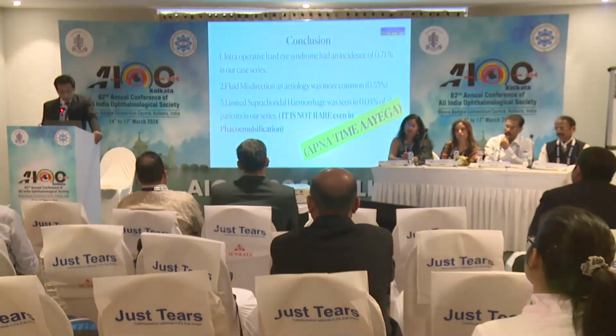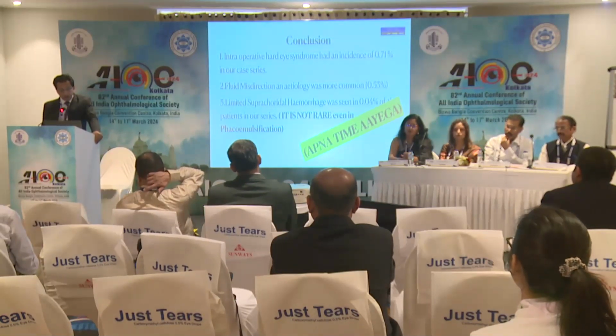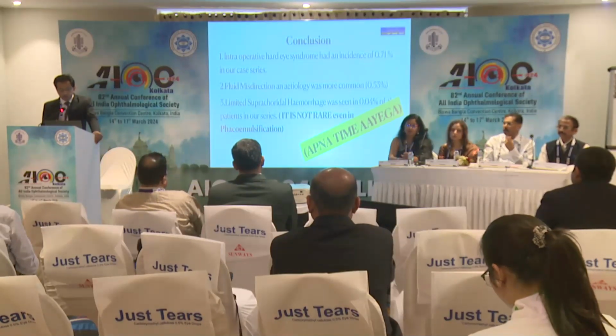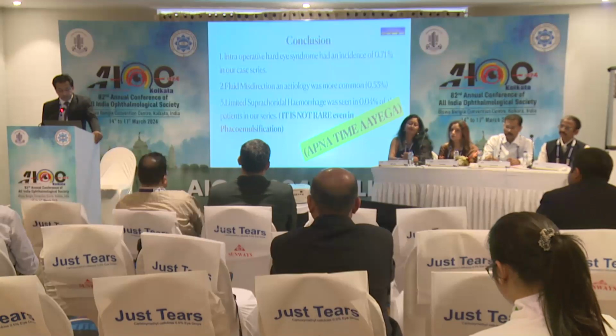The patient regained vision. So to conclude, an intraoperative hard eye is not very uncommon, and fluid misdirection is the most common cause. But it is not rare to have suprachoroidal hemorrhage. The only thing is, diagnosis is difficult. I thought I could never have one, but it's just a matter of time. Apna time zarur aayega. That is what I learned from this series which I had.